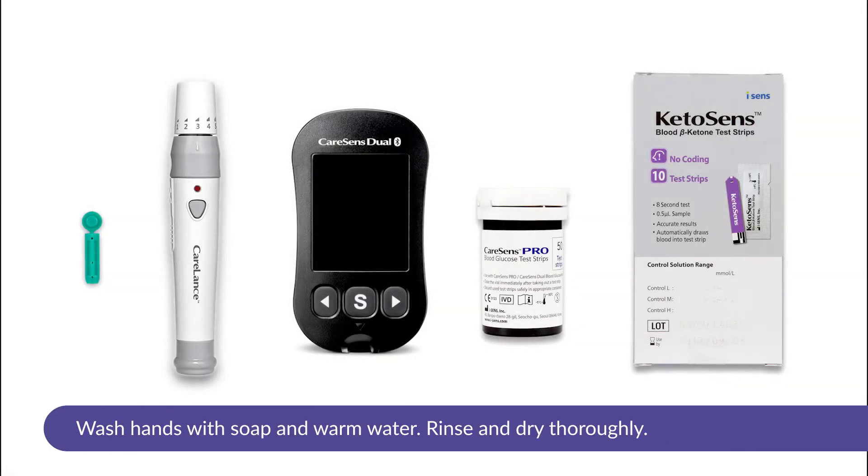Wash hands with soap and warm water, rinse and dry thoroughly. Obtain a capillary blood sample using a lancet.